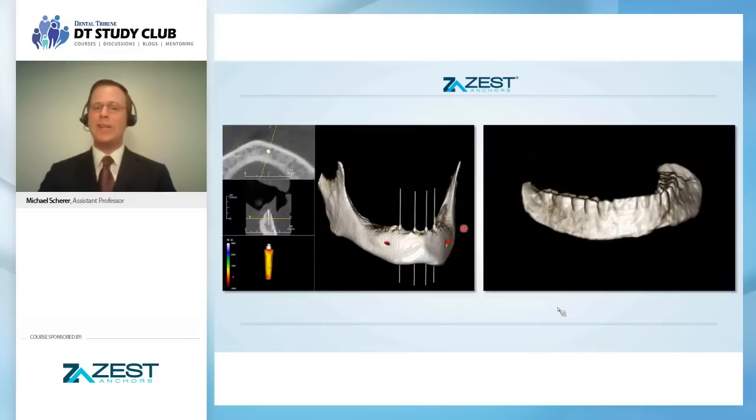But one thing we also really love to do at my two universities is cone beam imaging. I'm really loving cone beam imaging because it takes a lot of the guesswork out of panoramic radiology. How many times have you opened up a mandibular ridge, if you are placing implants in your practice right now, and gone, whoa, that bone is really not there, what I thought was on the ridge. Cone beam imaging is so pervasive in the marketplace that it's almost impossible not to be within a close enough distance to refer a patient to a scan center if you don't have this type of technology in your offices.